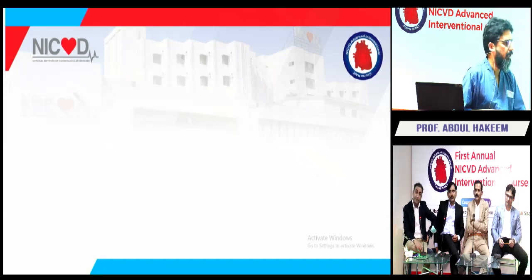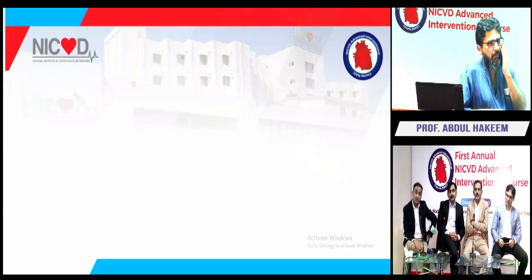Then you can take your time, engage with guides, use the back end of the wire to puncture through that calcified jailed leaflet. You can do like 10 different maneuvers. But the first thing is to put the patient on pump, put the patient on ECMO.